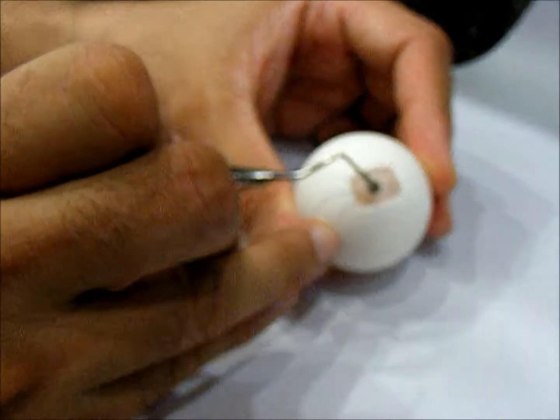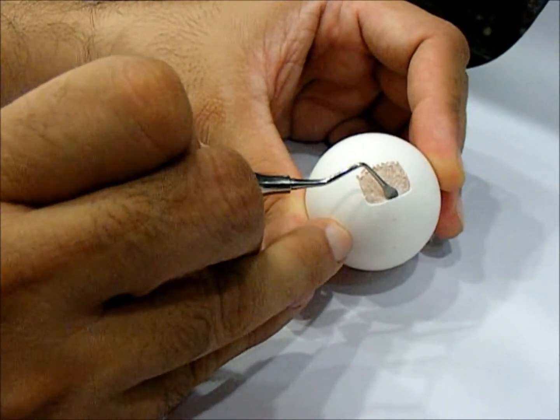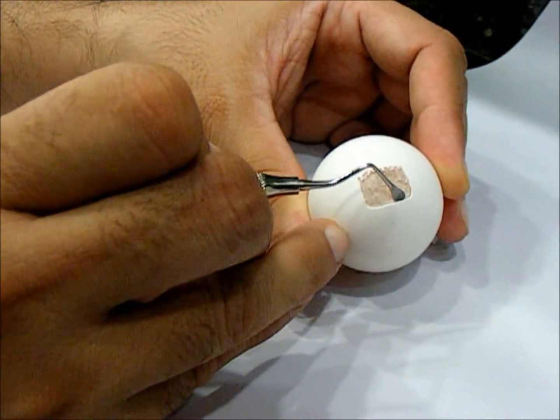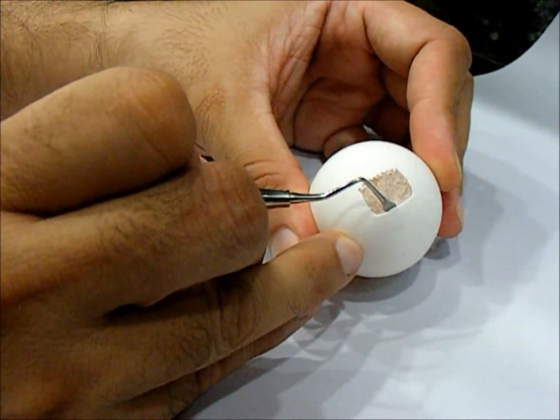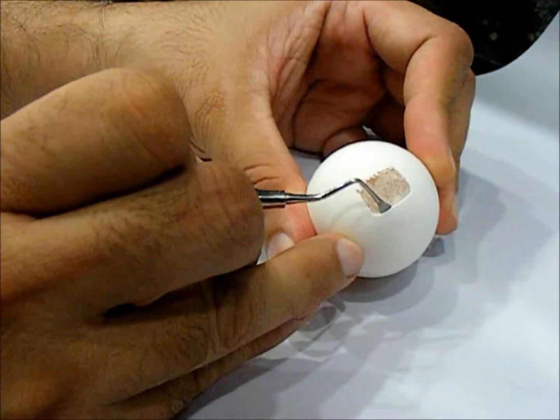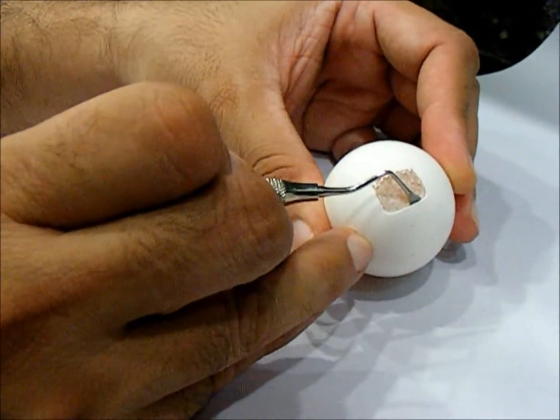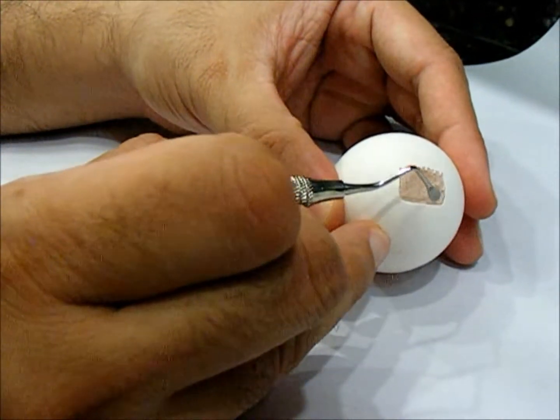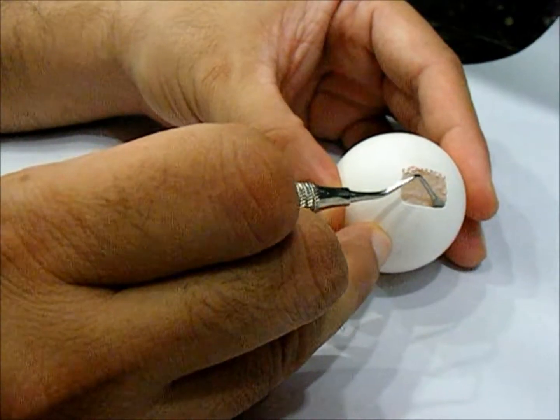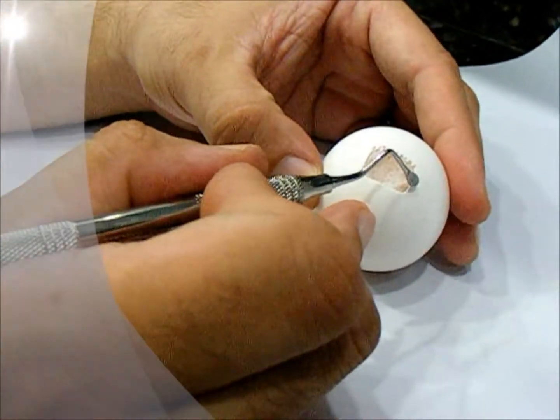As we are starting to peel, remember to maintain the flat end towards the bone and the soft rounded end towards the Schneiderian membrane. Here we go — you notice we are slowly but steadily peeling away the Schneiderian membrane from the bone without rupturing it.